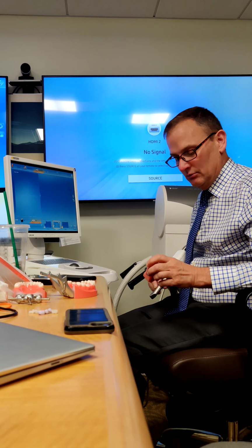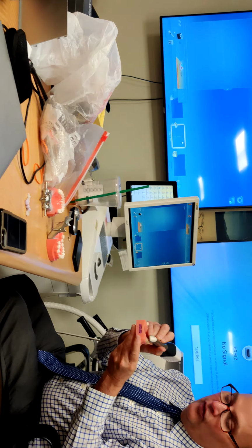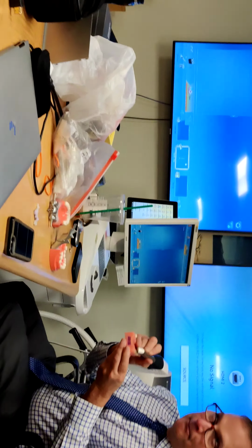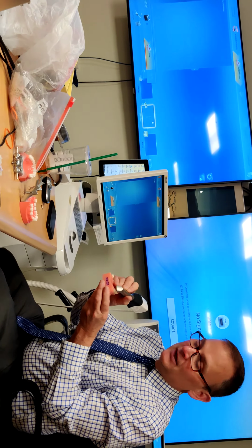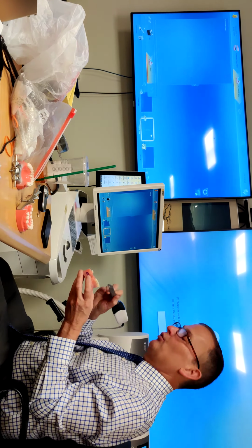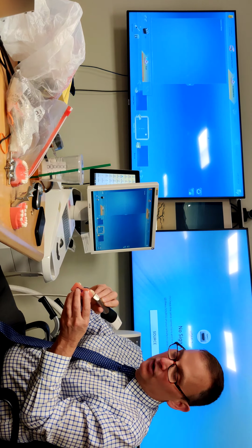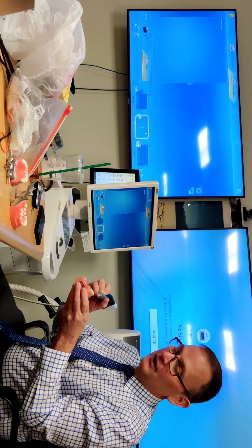Did I tell it what tooth number? I did, right? 13. So now, historically, we would scan on the occlusal first, because with Blue Cam and Red Cam it needed to see the occlusion and then you would drop down. If you read the research, the newest protocol is actually scanning starting on the buccal and around.